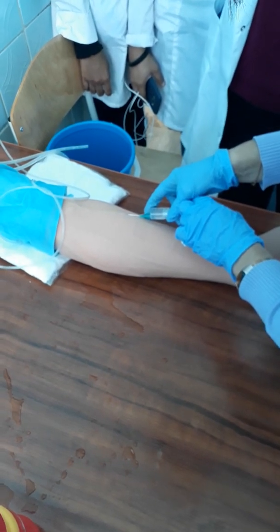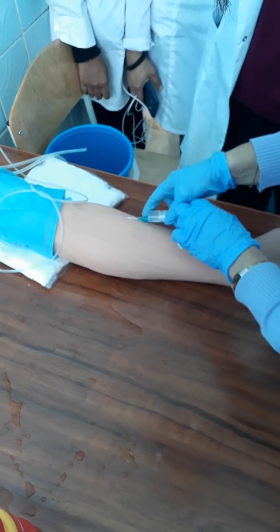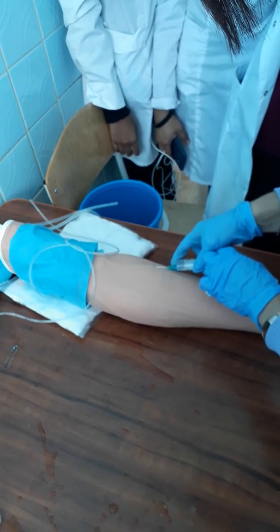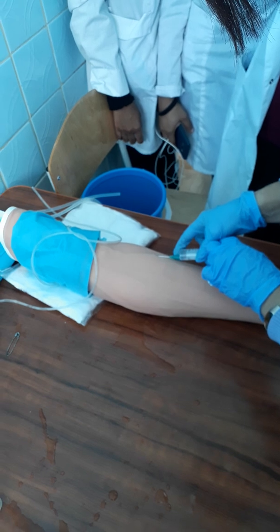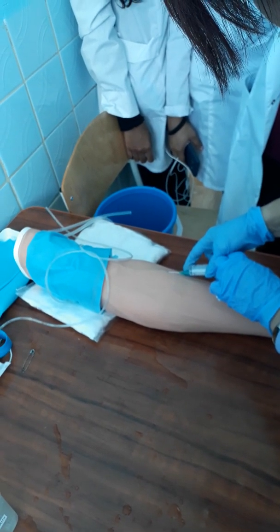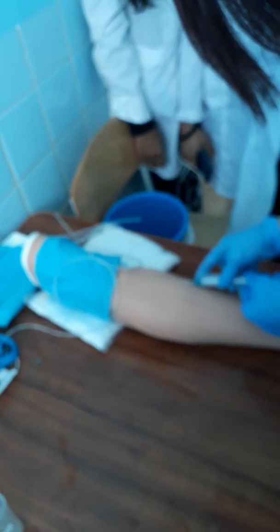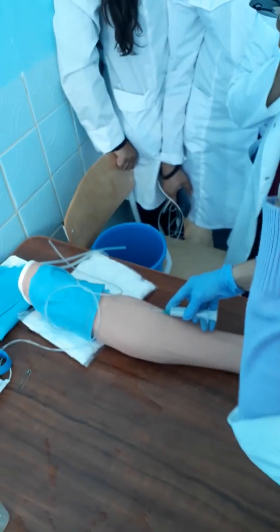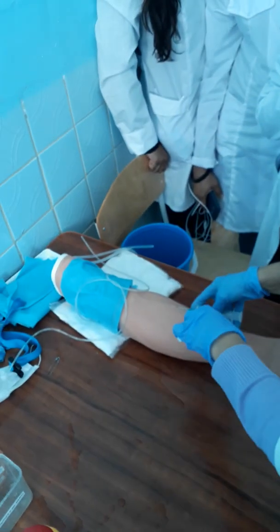And you see how our solution flows in the tube. It's some mistake. It is forbidden to administrate all the solution. So leave less than half a milliliter. You cannot press all the solution.